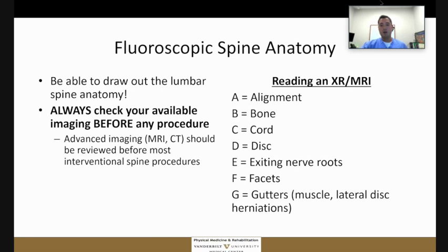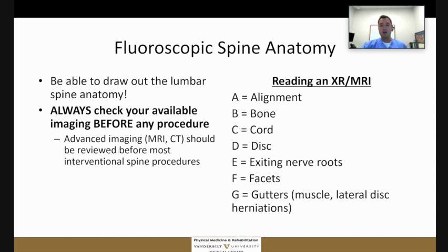An important thing as a medical student is to have a systematic way of approaching reading an image or even history-taking. I follow the ABCs when I approach an X-ray or an MRI: A stands for alignment, B is bone, C is the cord if you're looking at MRI, D stands for disc, E for exiting nerve roots, F for facets, and G for gutter — meaning anything lateral to the central components, such as the muscle or even lateral disc herniations. Essentially, just have a systematic way of approaching imaging so you don't feel like you're missing something.